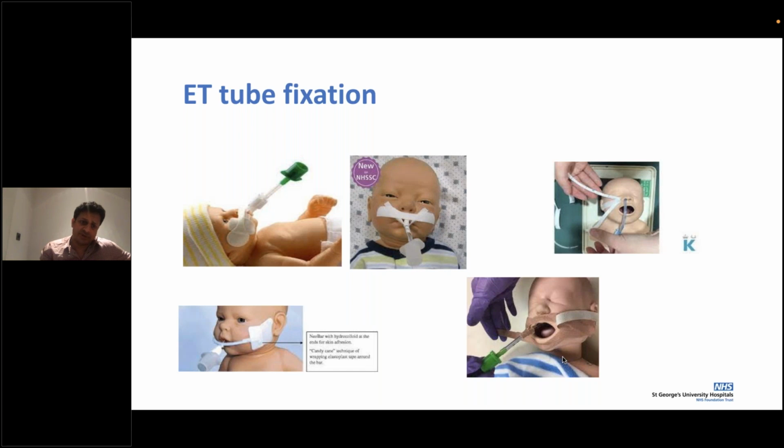Fixing, there are a number of ways, so different units will have different practice. What is important is that you get a feel for how the ET tube is fixed when you start on the neonatal unit. The fixing is quite confusing. Quite often a hat is used in most neonatal units. There are units who don't use a hat at all, which is again good. It's safer for the ear, there's no tight pressure around the ear, and it's easier to monitor pressure sores. But all in all, try and make sure you are familiar with how the unit's endotracheal tube is fixed.